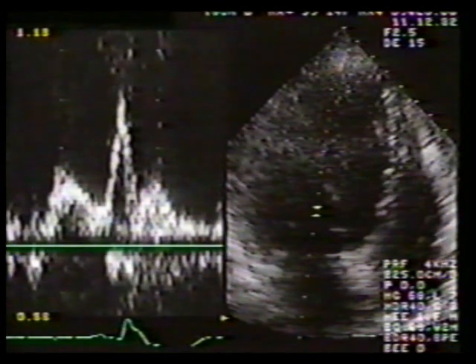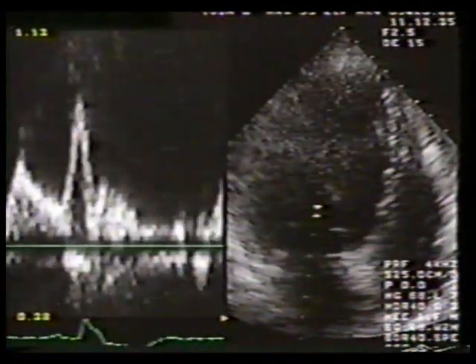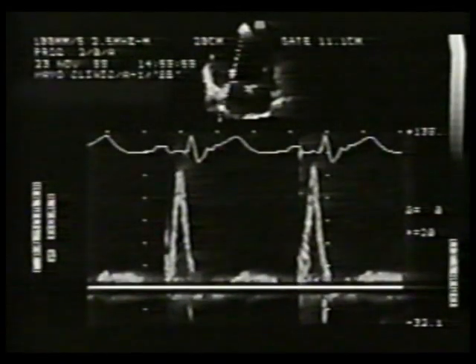We currently recognize 2 different abnormal diastolic patterns. Patients with dilated cardiomyopathy can have either pattern. This is the more common. The A velocity is very prominent compared to the reduced E velocity, and the deceleration slope is prolonged. This is the pattern of abnormal relaxation.